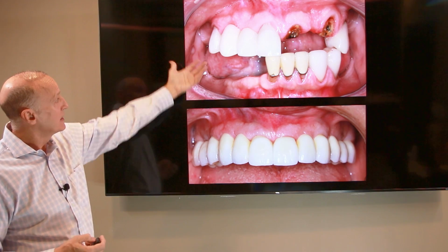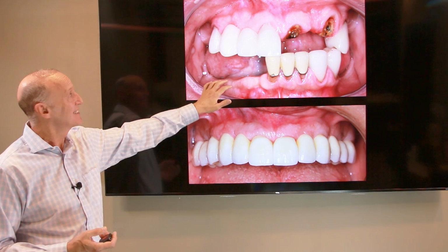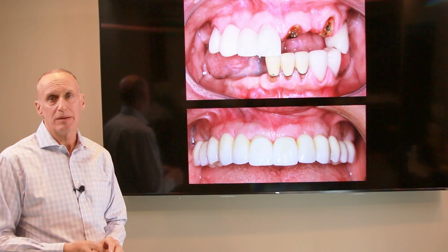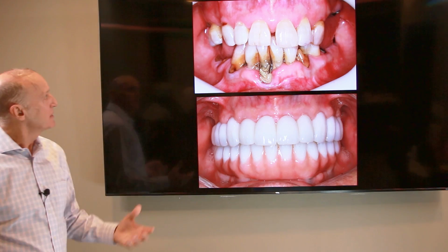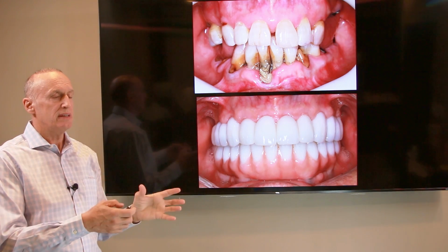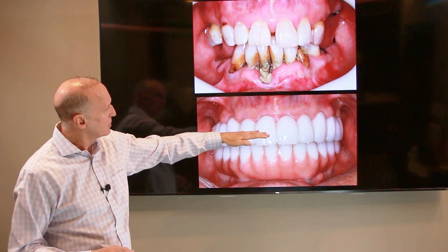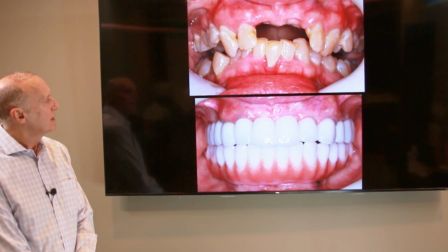And again, you take somebody. Now, most doctors that do implants would look at a patient like this and say, well, she's been missing these teeth for decades, and say, well, then All-On-4 is her only option. Well, genetically, she had good bone, so we used it. We didn't take any bone away in either arch. Another case you may have seen, had some good teeth. She was a patient that we transitioned from teeth to teeth plus implants to just implants. And again, and we'll get to this at the very end of the presentation, but we can't always do teeth only when patients have missing bone. We'll talk about that.